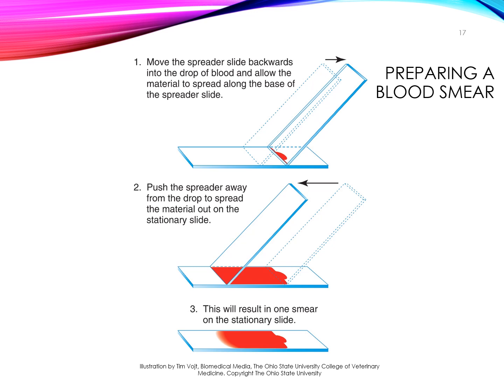We don't want the edges of the blood going off the slide. We do want that bullet shape where the entire shape is on the slide. And it isn't very important to make it perfect here because we use only a part of the slide to read the CBC specifically and do the platelet count, which we'll talk about more in the next slide. And this is another reason why we use EDTA tubes to do CBCs and blood smears, because EDTA specifically preserves cell morphology so that we can look at it under the microscope.